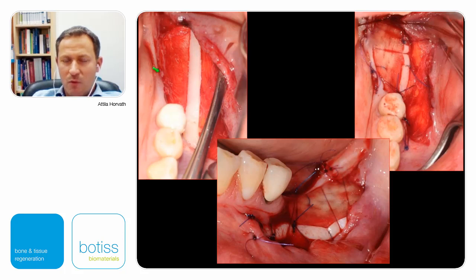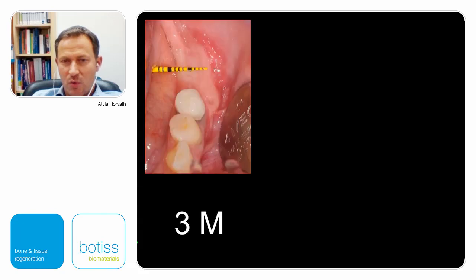In between the mucogingival junction and the epithelial graft, we placed the mucoderm, the xenograft. As a result, and this is the most important part in order to reduce the contraction and resorption of the graft, we placed like a stop line, like a barrier, the ECTG, the autograft, but just a very narrow layer, and the whole lot has been replaced by mucoderm. So we did not need to open and remove such a huge chunk of tissue from the patient's palate, which he was very happy with.